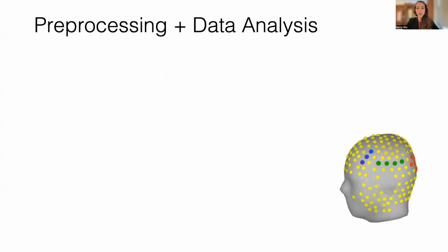We pre-process data using the semi-automated ARTIST pipeline, and feel free to ask questions about that in the Q&A. We calculated time frequency representations of EEG using the FieldTrip Toolbox in MATLAB, applying a sliding window spectral analysis with Morlet wavelets to each 4.9 second epoch of cleaned EEG.